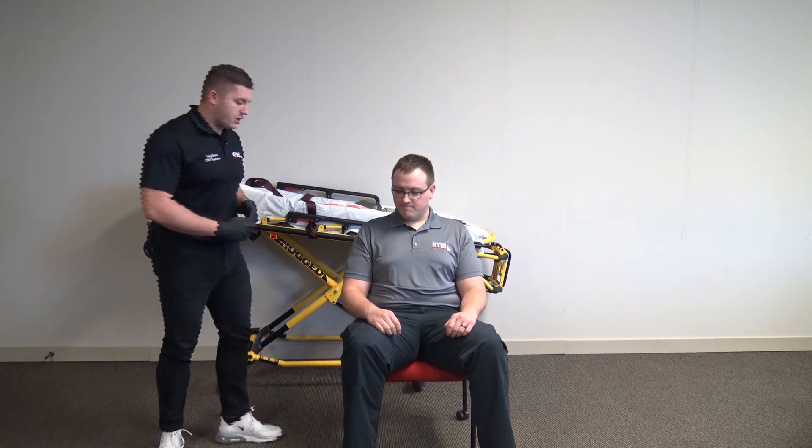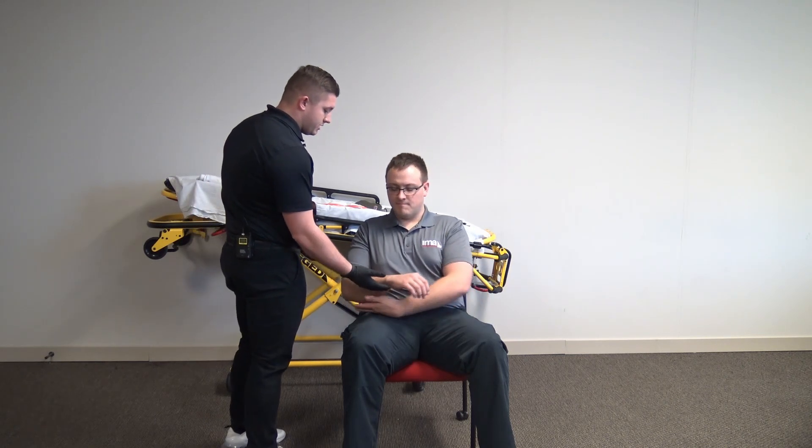Alright, BSI scene safe. I've been informed by my proctor my patient has an obvious deformity to their right arm. I'm going to go ahead and make sure my patient is manually stabilizing that extremity. Go ahead and put it in a position that's most comfortable for you.